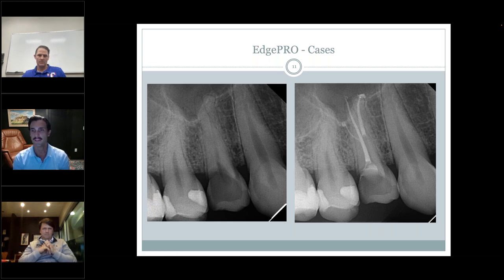with sealer. And to me, as the others have said, that tells me that by using the laser energy and the laser activated irrigants, I was able to not only be confident that the laser energy got into that area, but that I was able to push some sealer out that extra canal, and again, turn this into a single visit, confident case, and send it back to the referring dentist for immediate restoration.